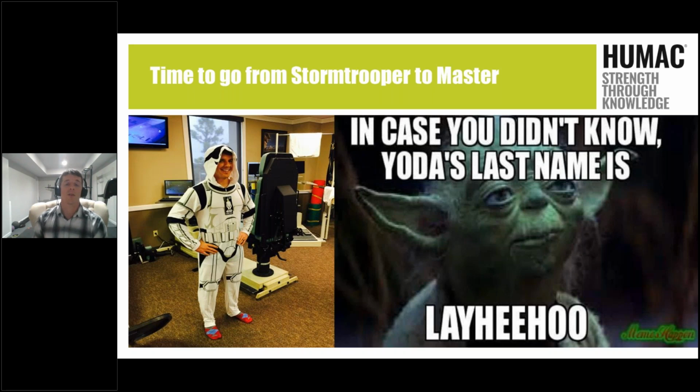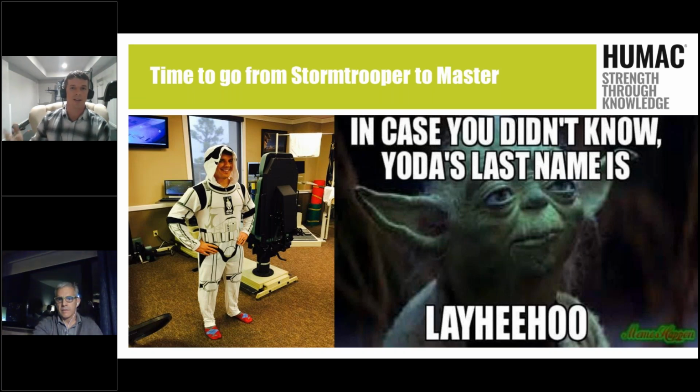Yeah. One thing to throw in on top of that is, if you can, invite your docs into the clinic. You can do an in-service right there, one-on-one with them, put them on the machine, and let them see what passive feels like, eccentric unloading, the multi-angle isometrics, beginning eccentric, and then take them through some of those progressions. You don't need to run them through 3 sets of 10. Throw in different steps along the way so they know what it feels like. They have a misconception that what we're doing is still high speed, back and forth, concentric loading.